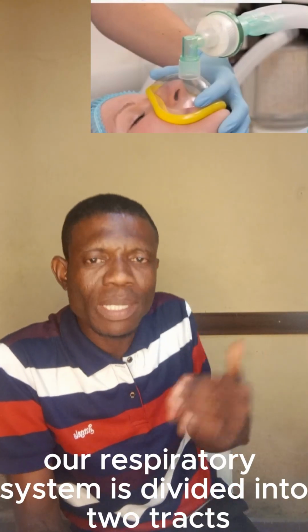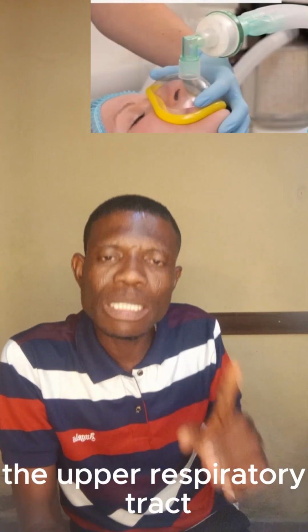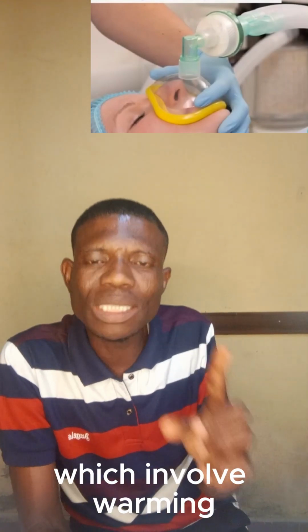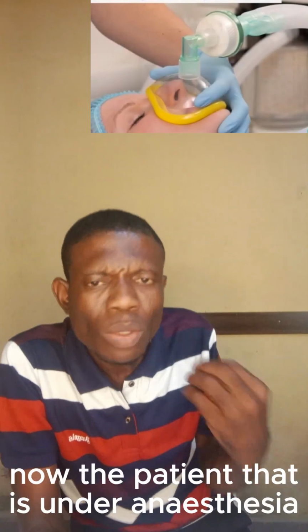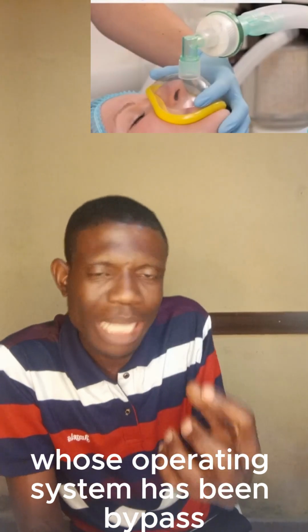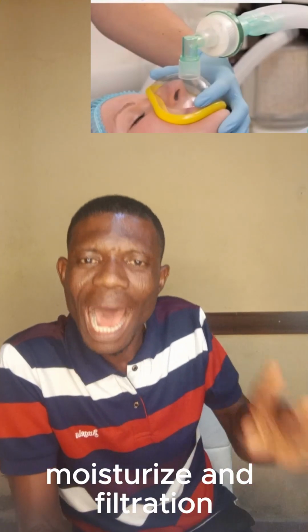Remember that our respiratory system is divided into two tracts, the upper respiratory tract and the lower respiratory tract. The upper respiratory tract, which is made up of the mouth, the nose, the pharynx, the larynx, the vocal cord, and the sinuses, does a special function in us which involves the warming, the moisturization, and the filtration of every inspired air. So now, for the patient under anesthesia whose upper respiratory system has been bypassed, what now performs this function of heat, moisturization, and filtration?